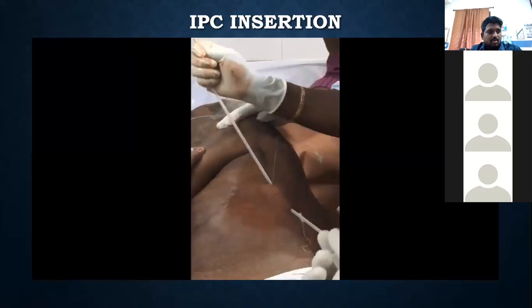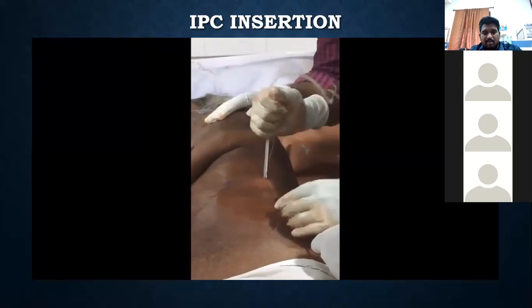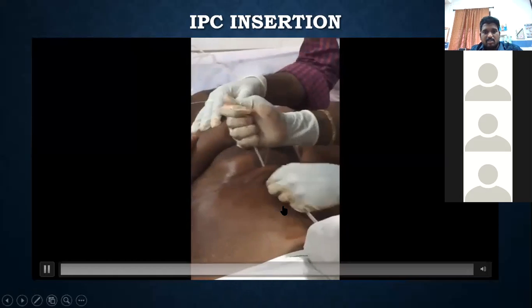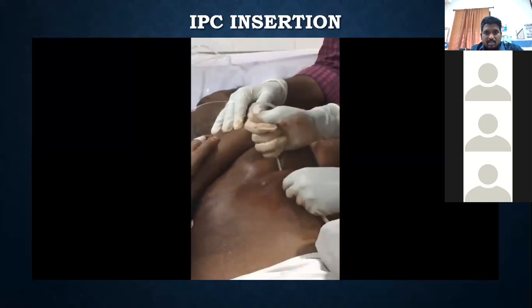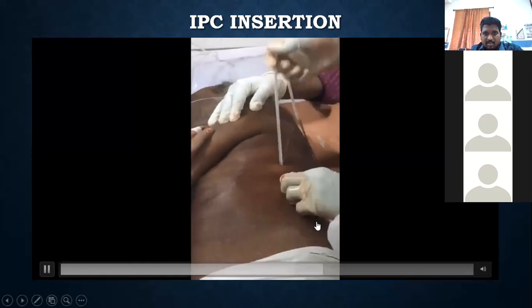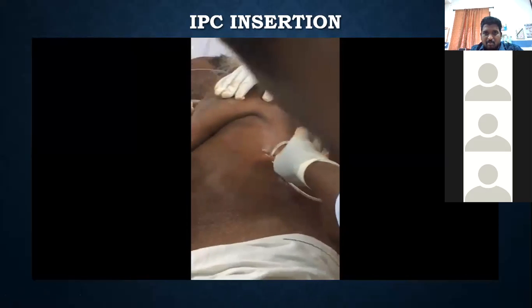It costs around 22,000. We use a Rocket set of indwelling pleural catheters, not the PleurX one. PleurX is still costlier. Okay, you could see that it has to snugly fit in the center. So now it's ready. Now you see that along the mount.